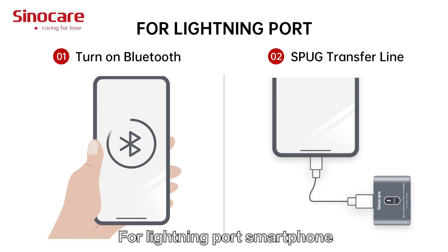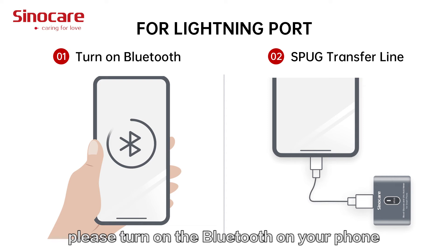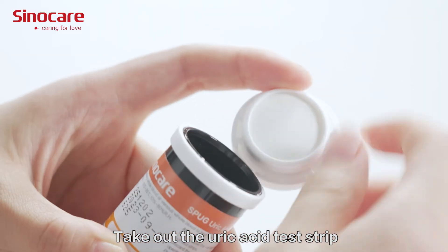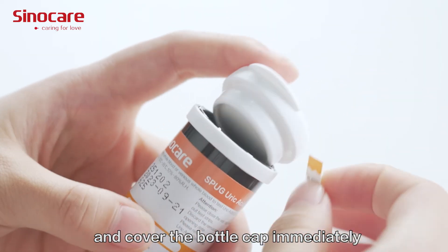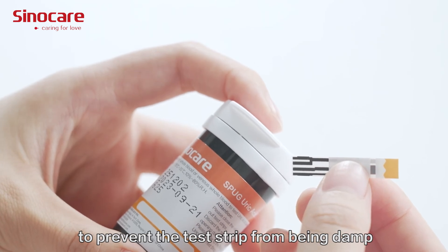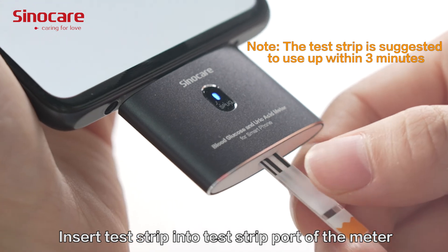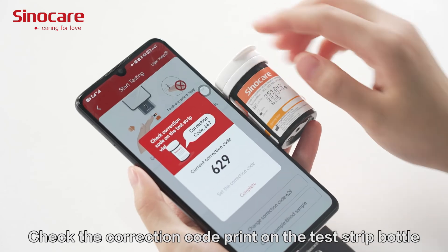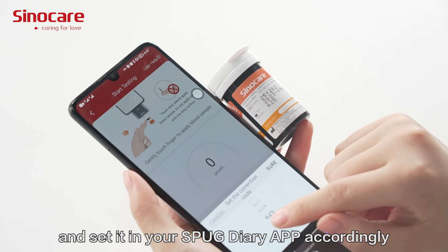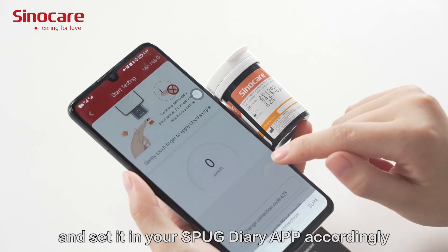For lightning port smartphones, please turn on Bluetooth on your phone before using the SPUG Transfer Line. Take out the uric acid test strip and cover the bottle cap immediately to prevent the test strip from becoming damp. Insert the test strip into the test strip port on the meter. Check the correction code printed on the test strip bottle and set it in your SPUG Diary app accordingly.